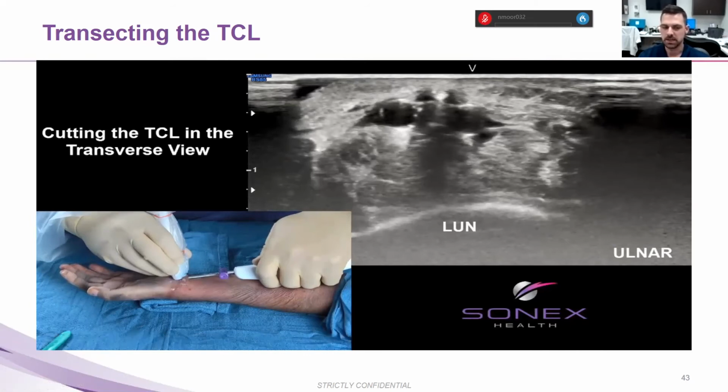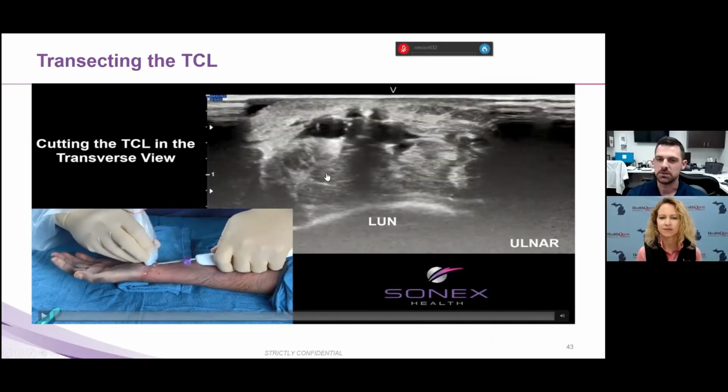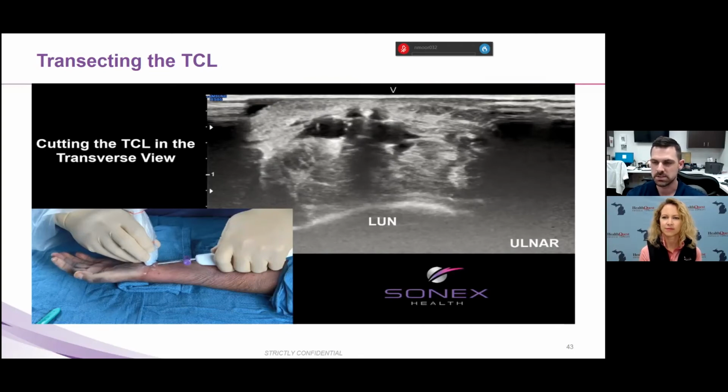And it's been a little bit of a political thing, in that not a lot of hand surgeons do ultrasound, and not a lot of hand surgeons want people like me doing carpal tunnel release. And so they're going to say that, oh, you're going to get a neurovascular injury, but really you're not going to engage a blade anywhere where you can't see what you're looking at. And so you have these safe zones that you've marked. You're watching that your blade is proximal to the SPA, and then you're turning short axis and watching that your blade is in between the artery and the nerve all the way until you've released through the transverse carpal ligament, and then your blade is recessed and clear.